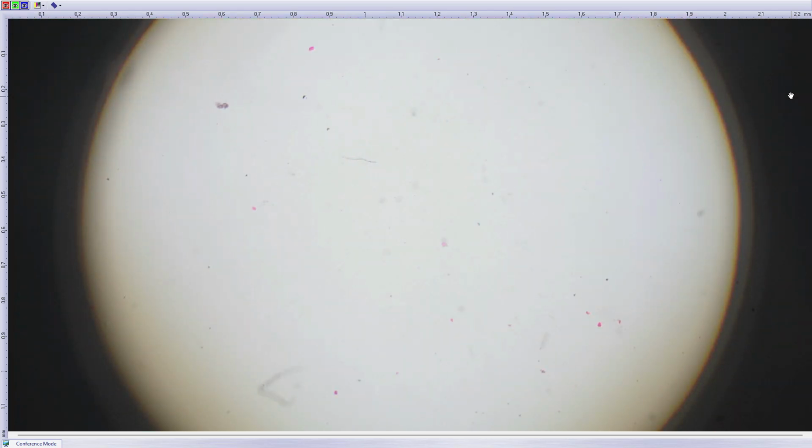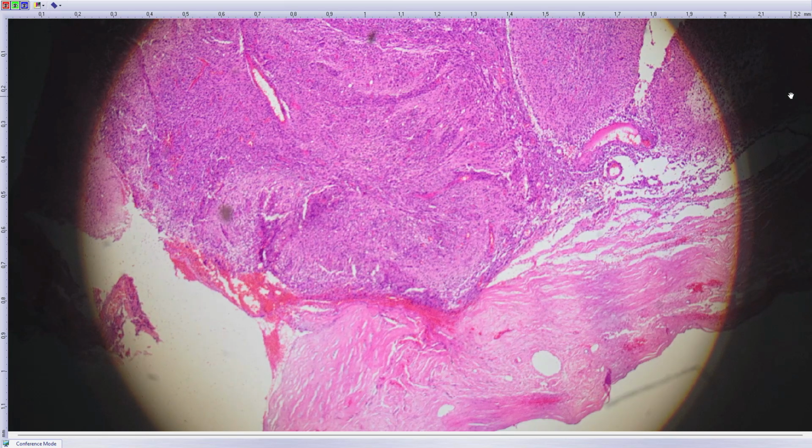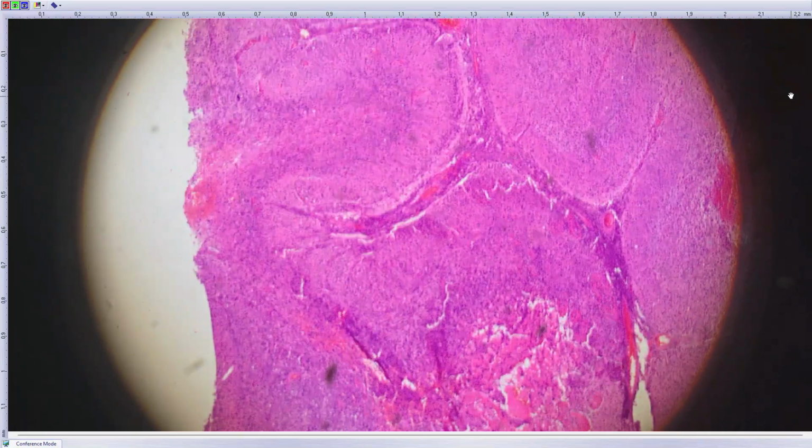Okay, I've got, I believe, only brain tumors right now. The first one came as a consult case. This is posterior fossa, so in the cerebellum. It's a young female patient. She's now 35 years old, but she has experienced recurrences of brain tumor for a couple of years. So many times excised, and there were many diagnoses made before at other departments.